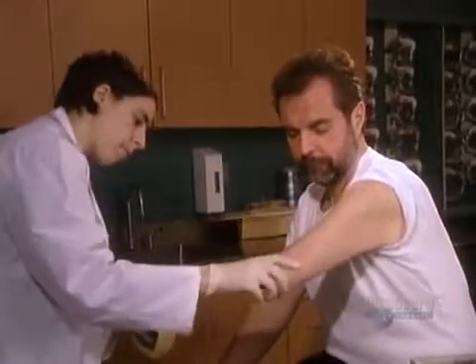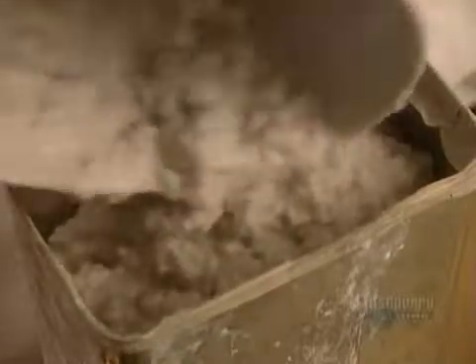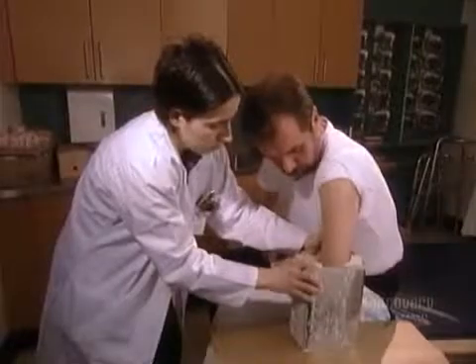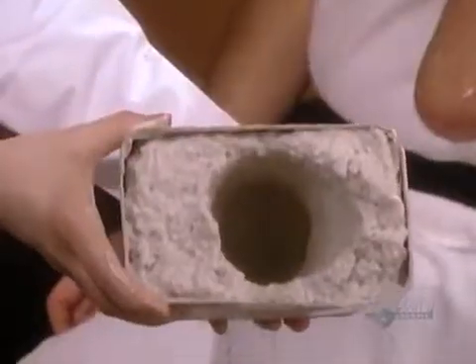They protect and lubricate the residual limb by coating it in petroleum jelly. Then they immerse it in algin, a gelatin-like substance that comes from algae. After about five minutes, they remove the residual limb.